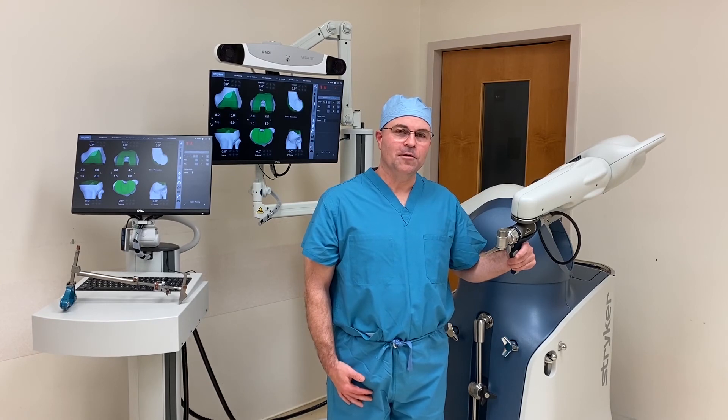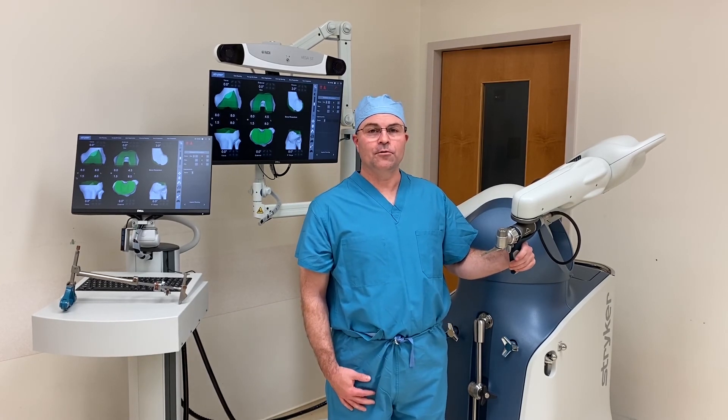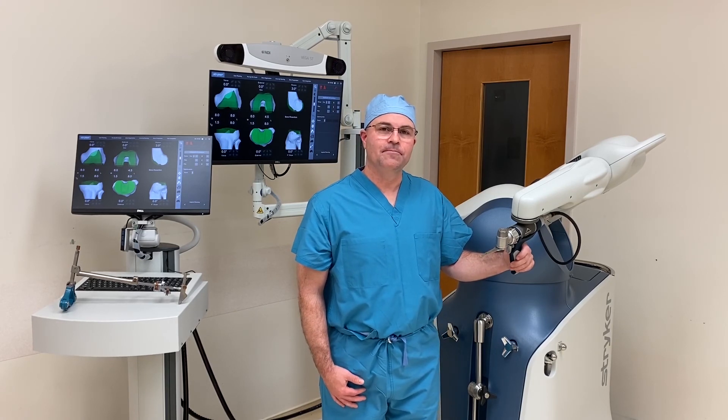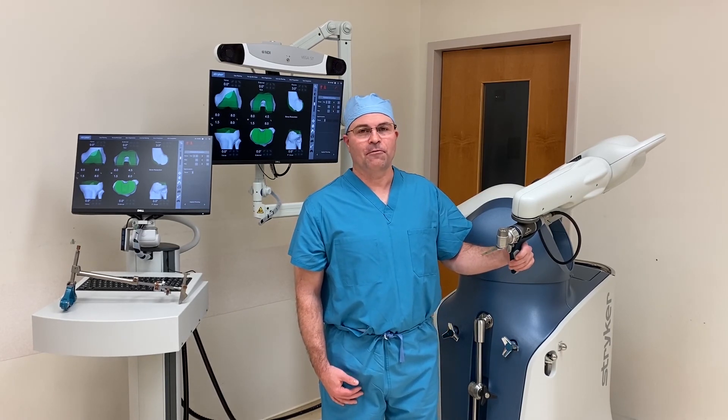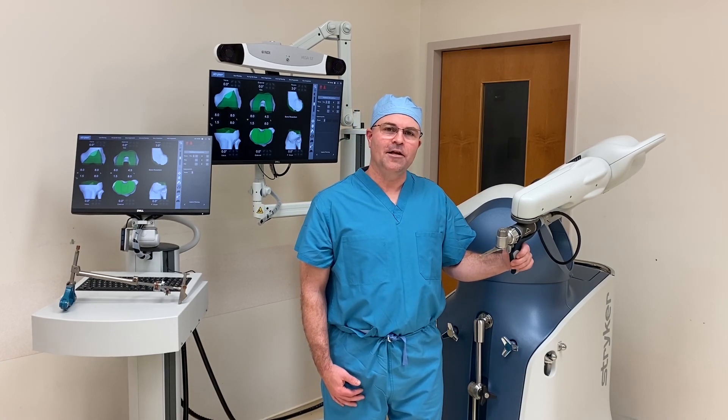Remember, when I do your knee replacement, I don't cut any muscles. And this robot is a very important tool that allows me to do that safely. So if you're suffering from arthritis and considering a knee replacement, come see me to find out if the Ready Knee is right for you.